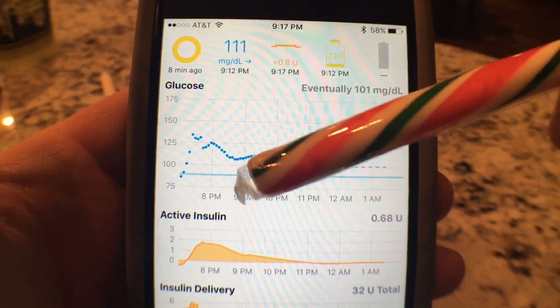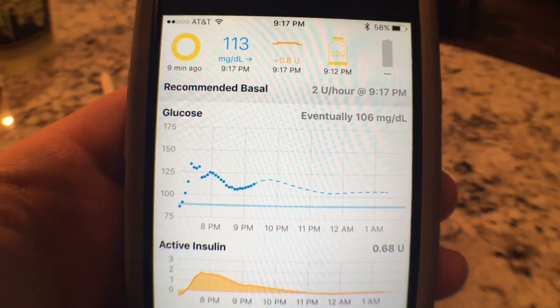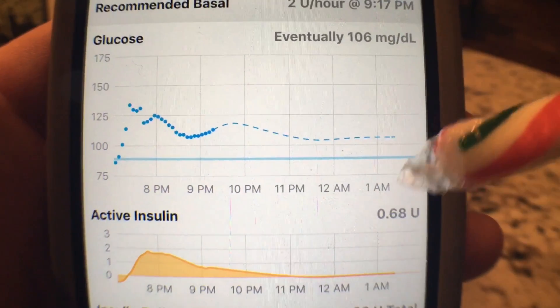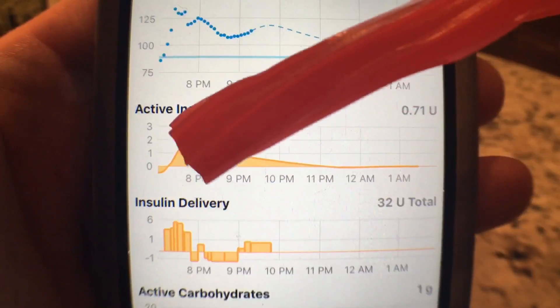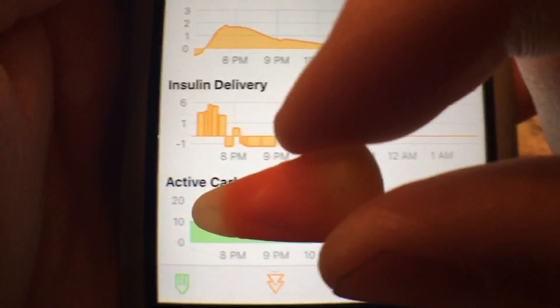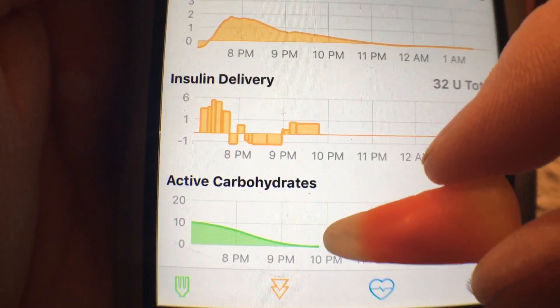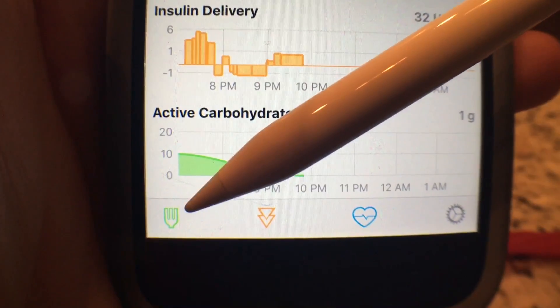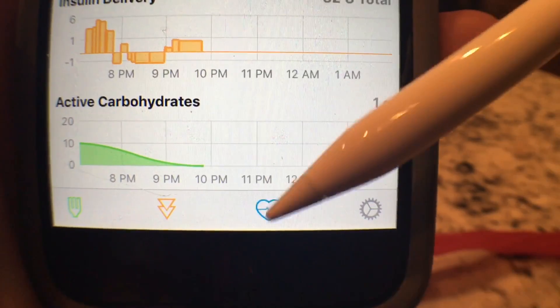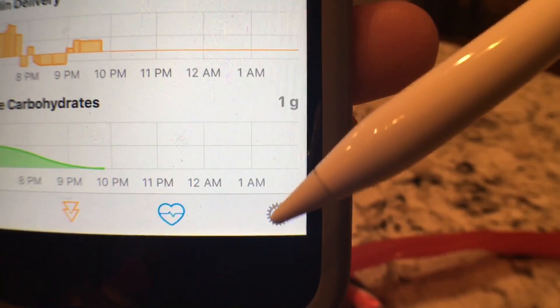That's what my current numbers are. Where this dotted hash line changes, that is my predicted glucose based off of what I have going right now. This blue line across the bottom is my target range — I have it set right now at about 90. This is the amount of insulin going through my system right now that's still active. This area here is the active carbohydrates — my dinner is basically done right around 10 o'clock. The fork is where you enter carbohydrates, these little triangles are where you give yourself a bolus of insulin, and this heart is where you set your workout patterns.